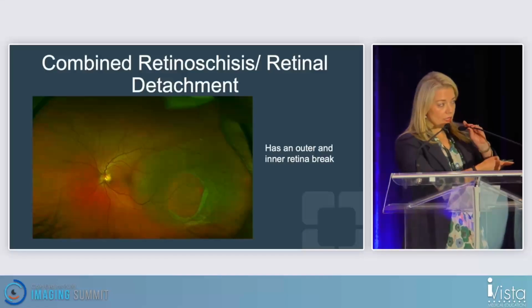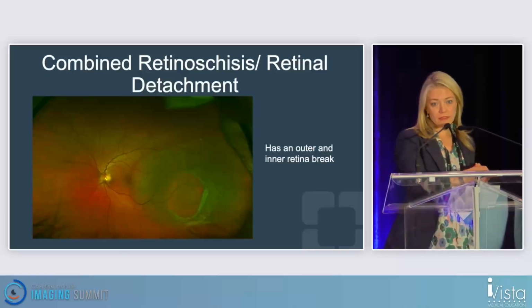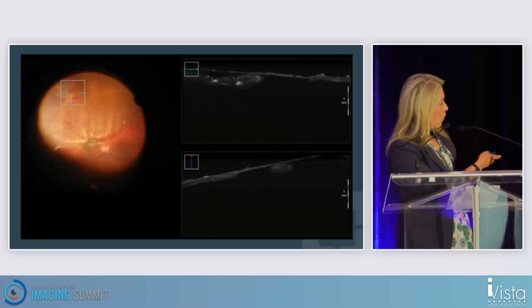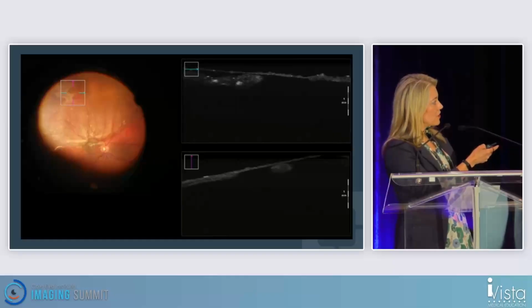But you're lucky if it looks like this, because most of the time the inner retinal defect is really, really hard to find. Like in this case, where we thought on the exam in clinic that we had the spot where there was that inner retinal defect, but when we imaged intraoperatively, we see that there's very thin inner retina and the outer retinal defect is here.